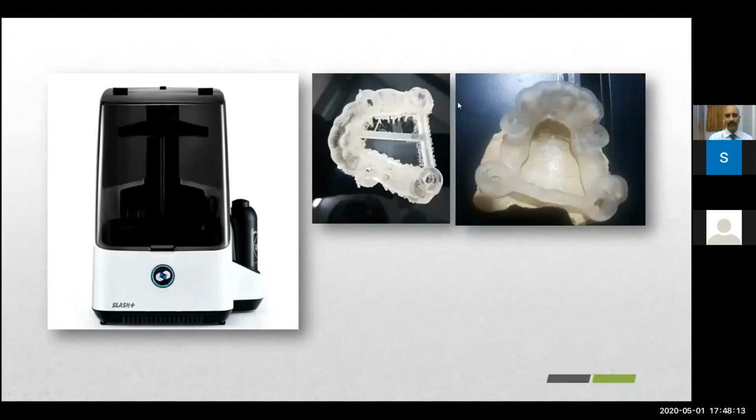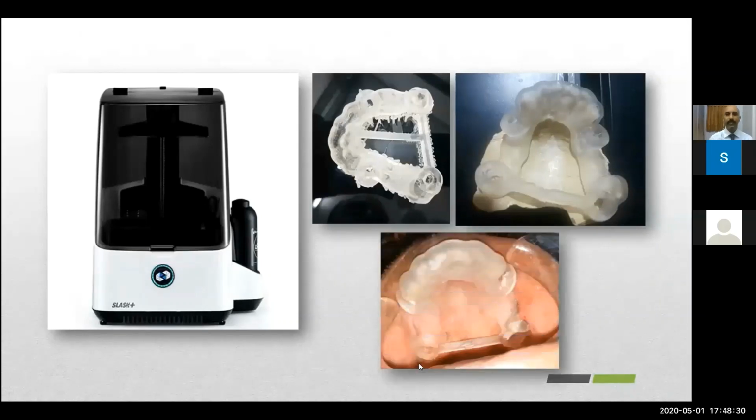Once that is done, it is placed upon the study model and finished off in a smoother manner so that all the rough edges are taken off and all these serrations are removed, so that this guide can fit perfectly inside the patient's oral cavity. Right now, this is fitted only on the model. Then this will be tried onto the patient's oral cavity. So this is how finally this particular guide, once it was printed and finished off, was inserted into the patient's oral cavity.